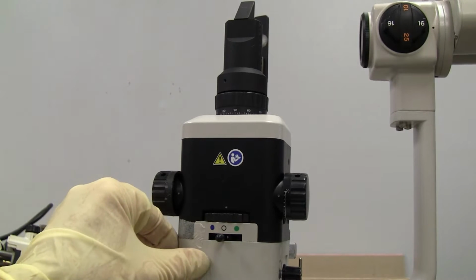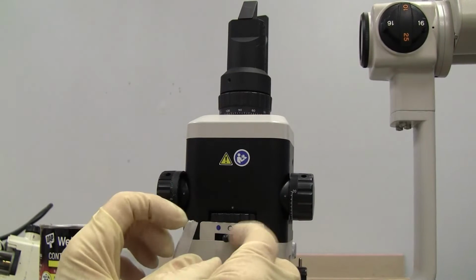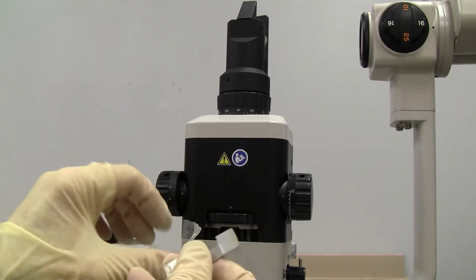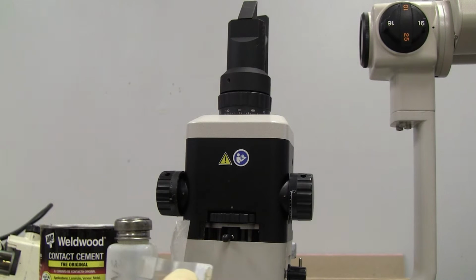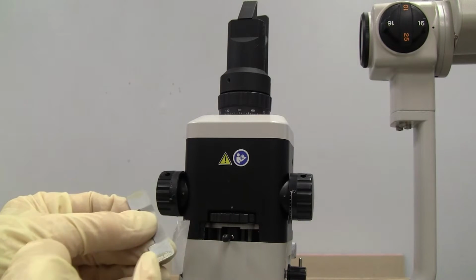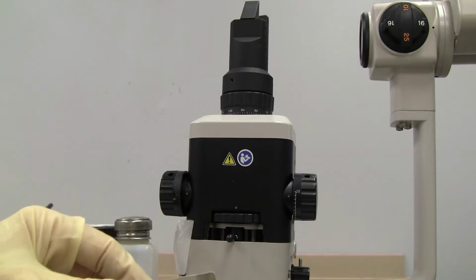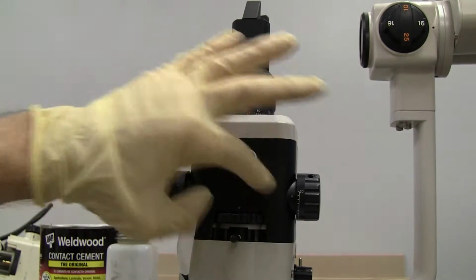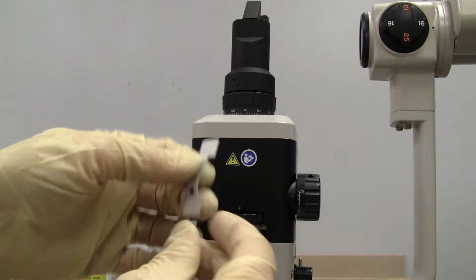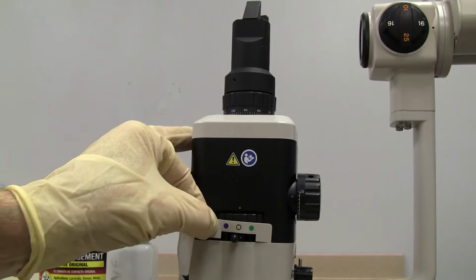One thing that's important is that this little cover sometimes comes off. It only has a little bit of adhesive on the edges, and it can come off from overuse. So if we were going to realign this, first thing we'd want to do is secure our cover over the filter wheel.